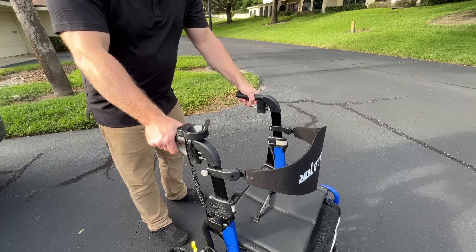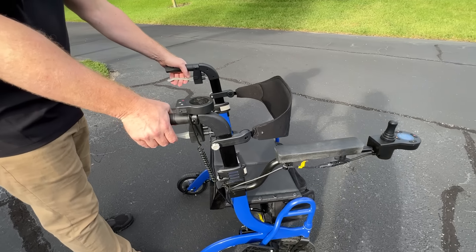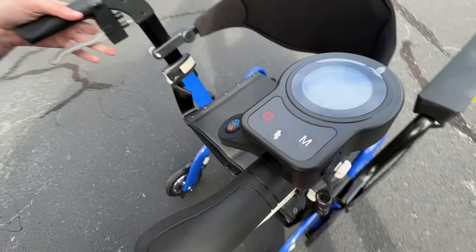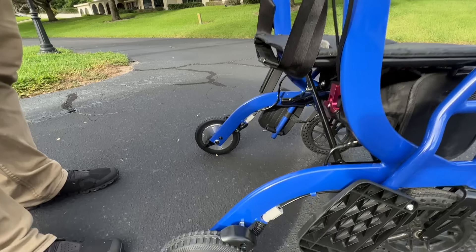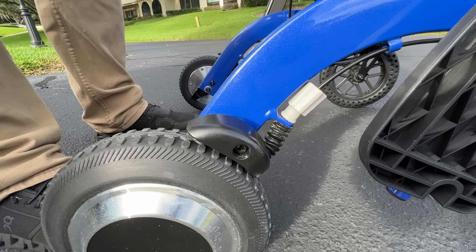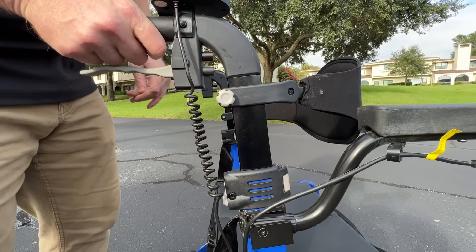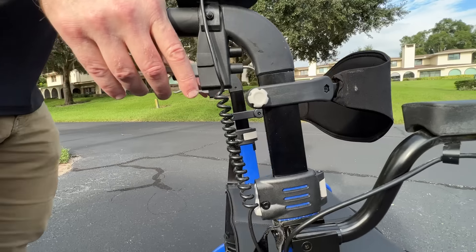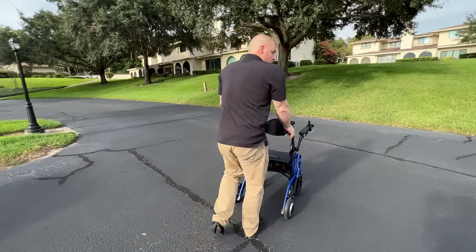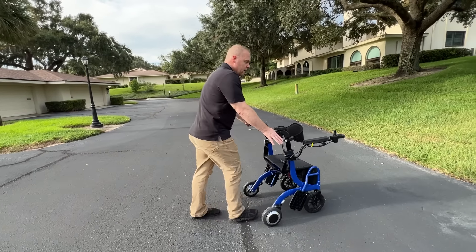I've got two brakes right here and I've got armrests that flip around — I can get that out of the way completely. When I use the hand brakes here, look at this action. This would just be like a regular rollator. And if I take a look at the handle here, I can lift this up or I can lower it. Functionally, we're using this as just a regular rollator. If I want to stop, I can stop, and I can move along.